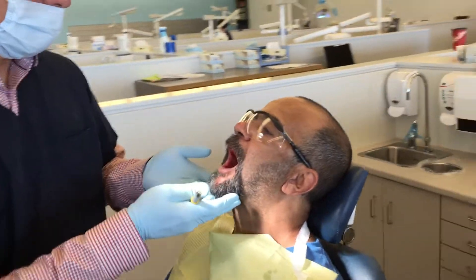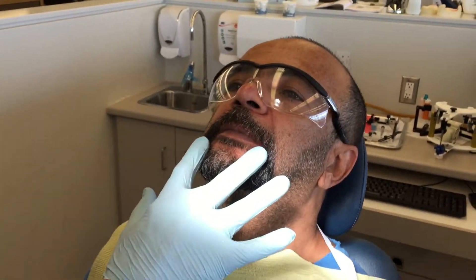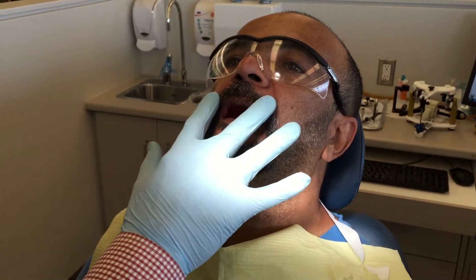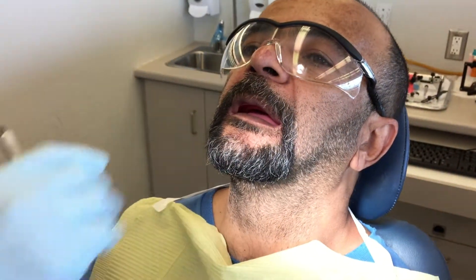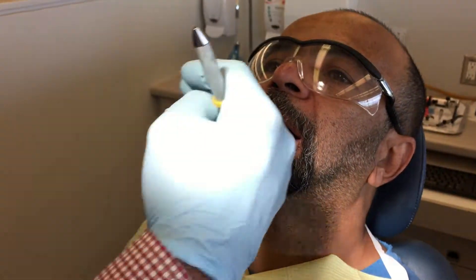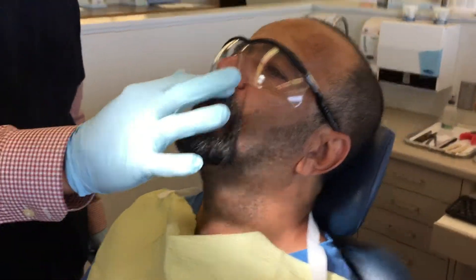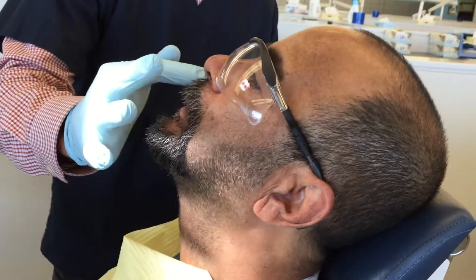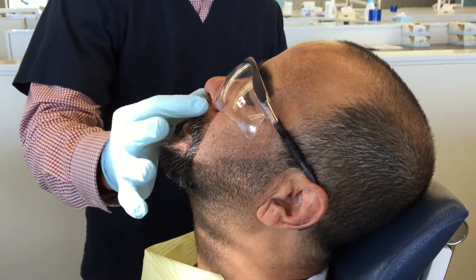What we're looking for here — get you to relax for me. Open slightly. Typically for males, we want the bite block just to be at the edge of the lip. That's where it is, and I think that's pretty good. But before we make any adjustments in terms of the length, we want to make sure that we have a nice full appearance here for Robert. I think here might be a little bit too full, so I might have to cut this back a little bit, because I see him a little bit puffy.